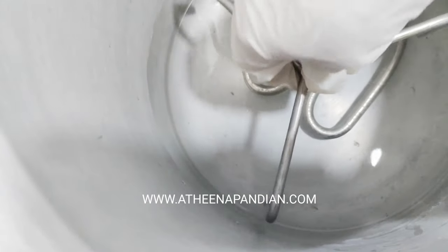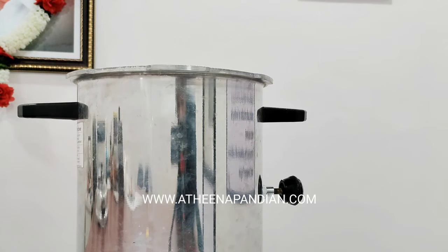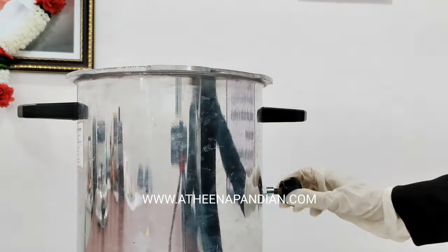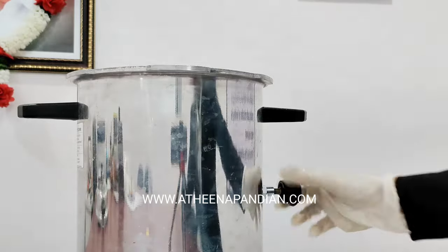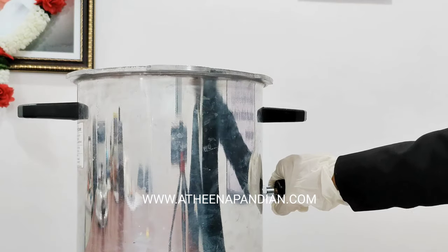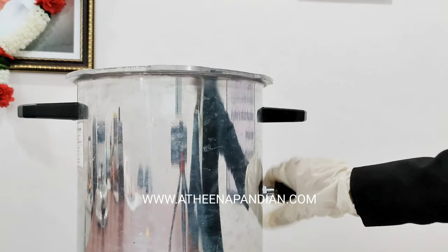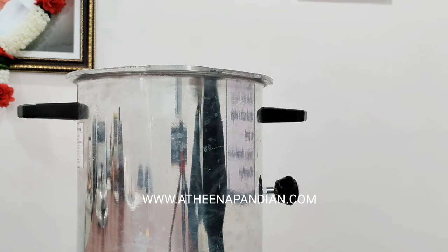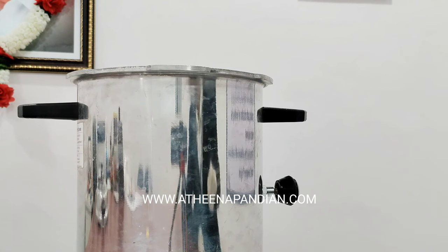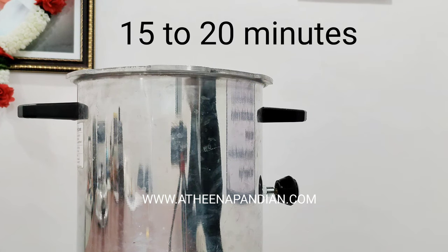Above this metal grid I am going to place my contents which are to be sterilized. First it is mandatory to check whether the steam releaser is in open or closed condition. Now it is in open condition, so I have to close it before starting the process. Now I have closed the steam releaser valve. I am going to close the cap and turn on the autoclave. This process takes about 15 to 20 minutes.